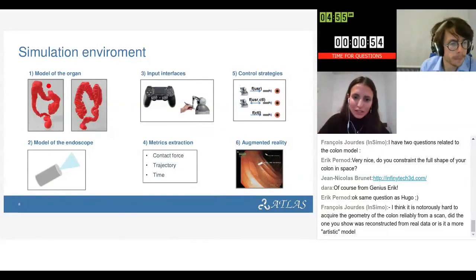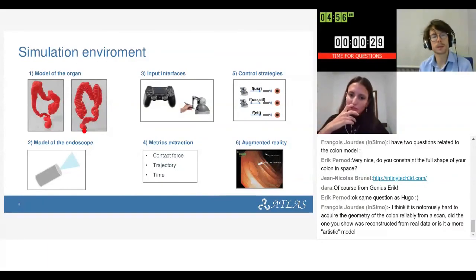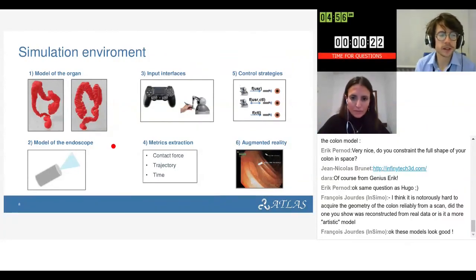But this one here, I reconstructed from 3D scans from CT colonographies. In these kinds of 3D models, maybe I will need to open up a bit these parts that are too small, too thin. So you need some additional work on top of it, but the results are not bad actually. Thank you for answering the points. It looks good.